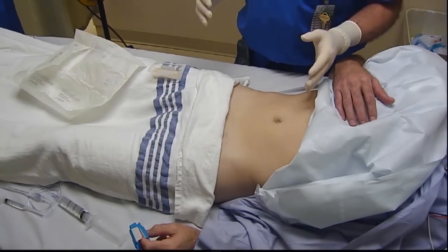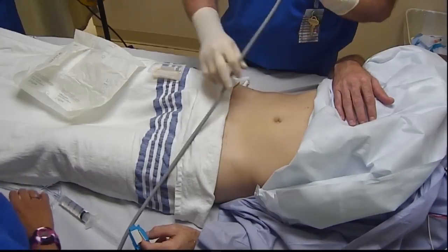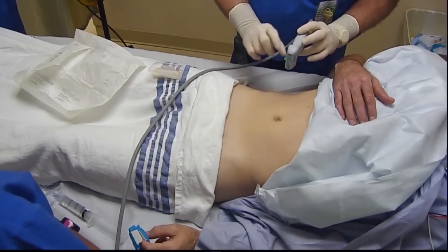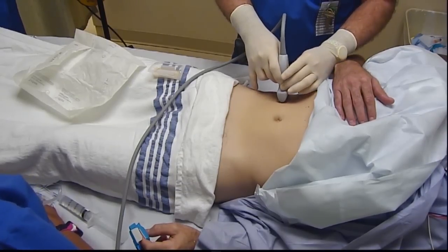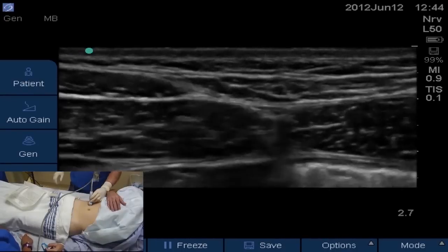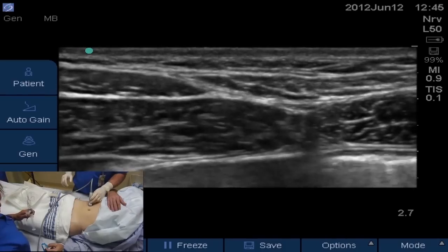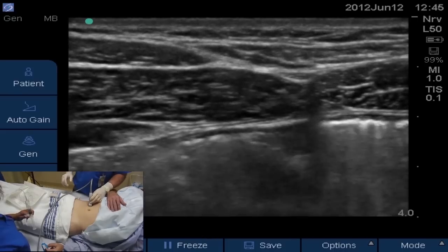We're doing a transabdominal plane block, or TAP block. We're going to go midway between the iliac crest and the lower costal margin, which usually ends up about the level of the umbilicus. I put the probe just on the anterior abdomen to the right of the screen. You can see the rectus abdominis muscle and the internal oblique coming up and abutting the rectus abdominis.